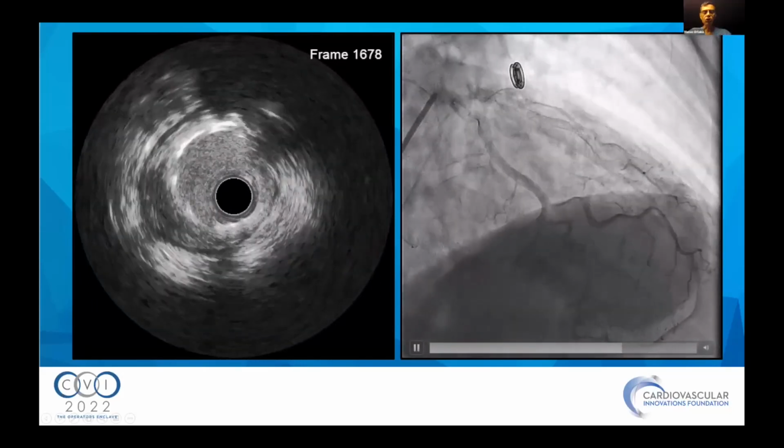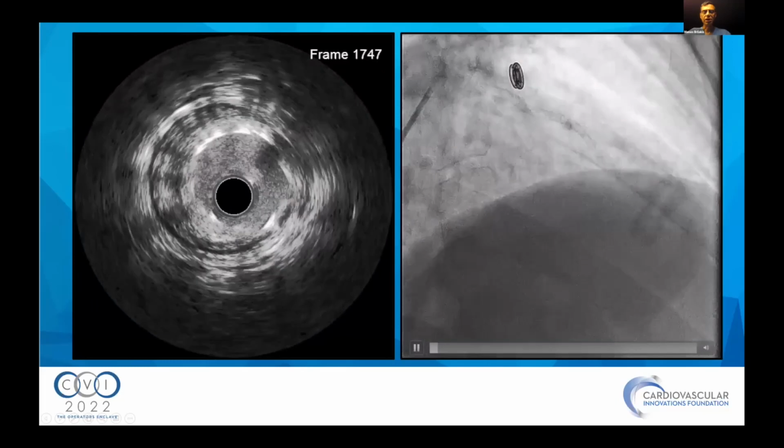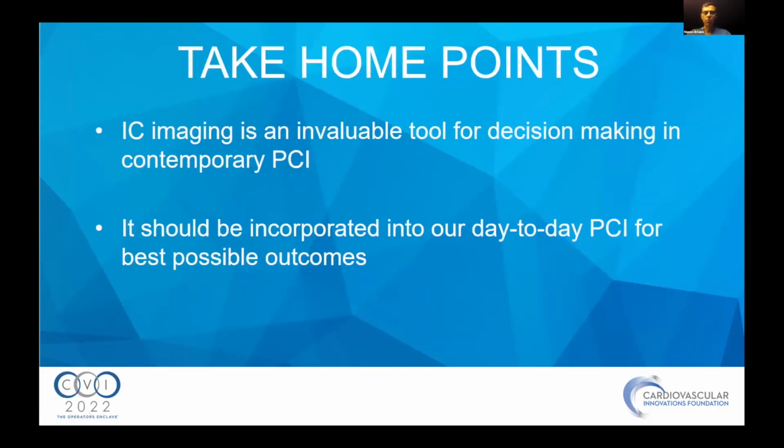Yeah, and I also think you should understand from the distal end, as you did, to cover distally so the hematoma doesn't go distally and compromise the vessel. So again, very, very well done.